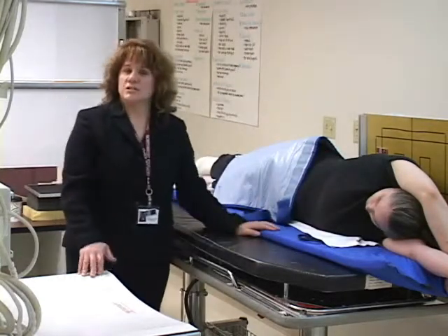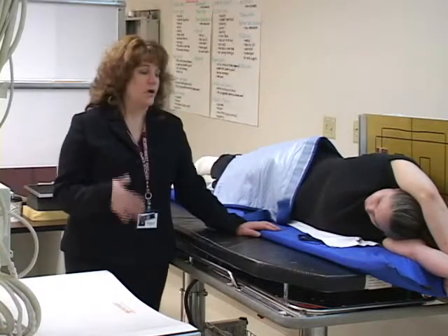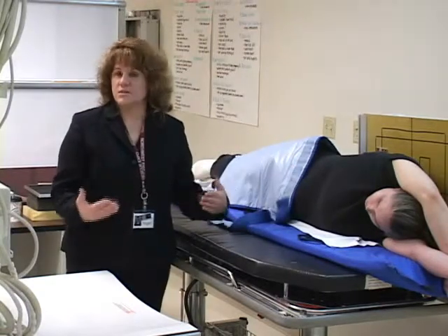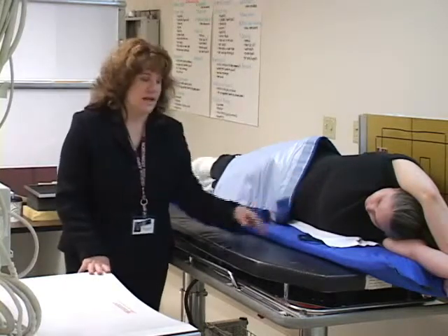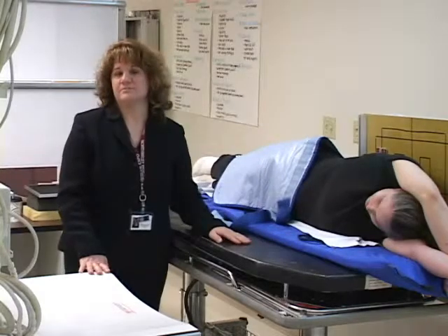I'm going to tell her to take in a great big deep breath when I'm ready, to blow it out, and to take in another deep breath and hold it in, and that's when I would take my film. I'm going to use a 14x17 IR because I want to get as much area as I can. Go ahead and breathe. And that's how I would take that film.